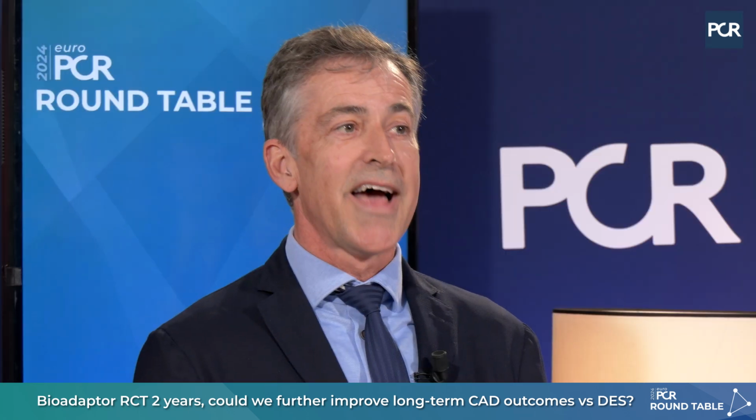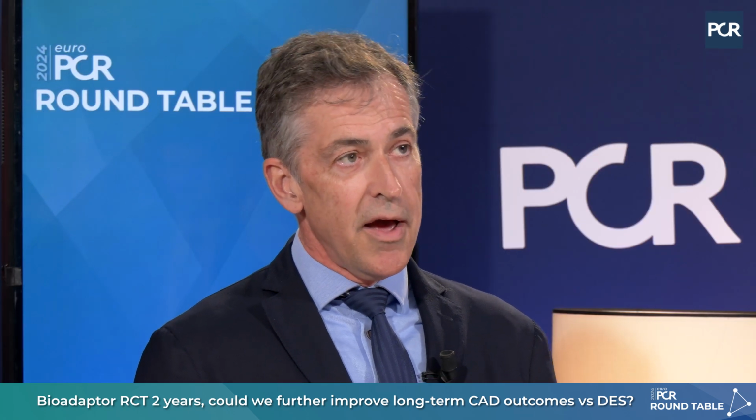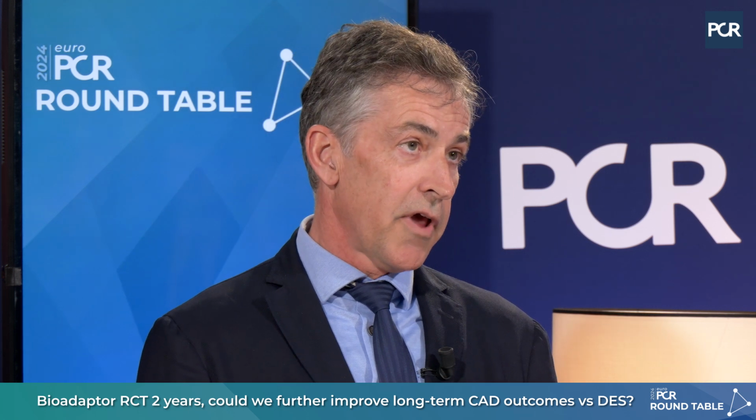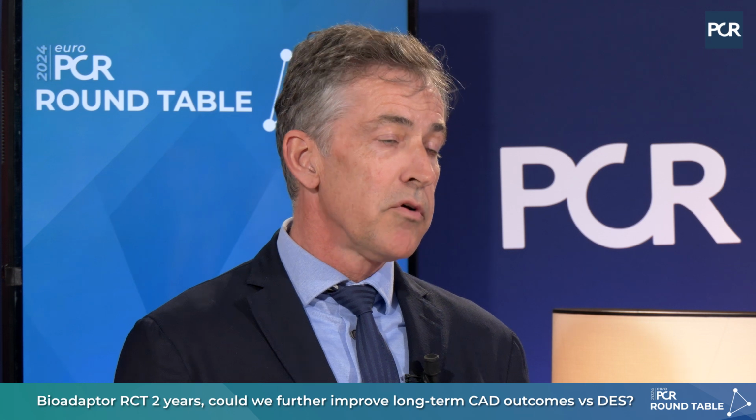Okay. So if it is novel, is it correct to say that this is a stent, or should we call it in another way? So what is the correct term? So they call it a Bioadaptor because it adapts to the movements, the physiological behavior of the vessel, so to say. It allows vasomotion capabilities. Okay, and this may address the issue that Antonio has commented.